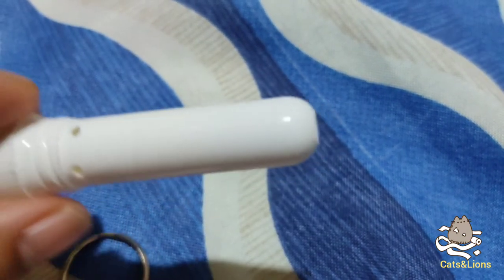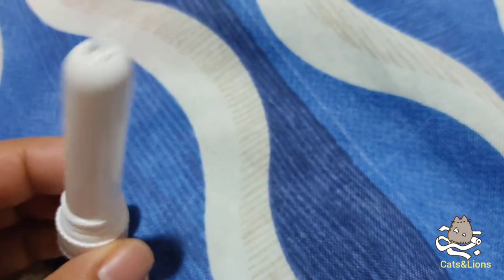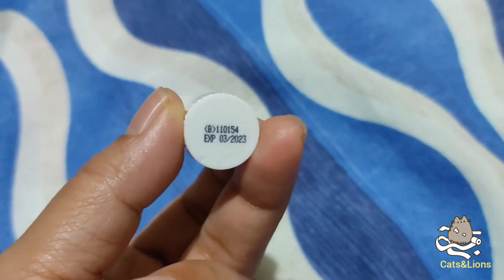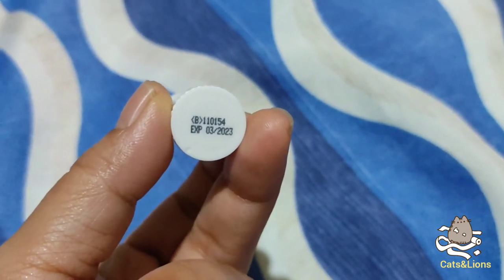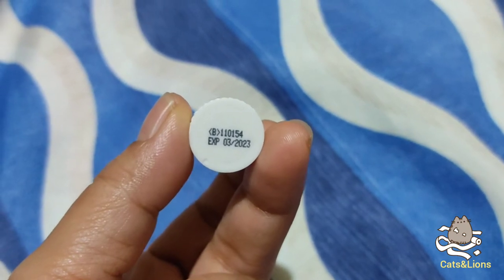The expiration date is actually imprinted at the bottom of the tube. This one is good until March 2023.